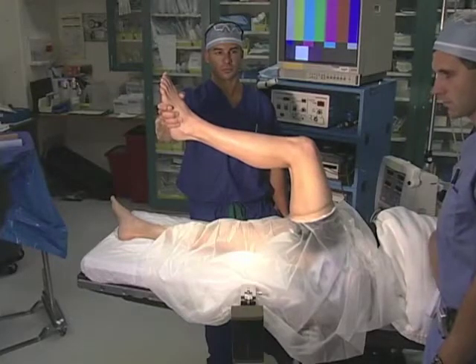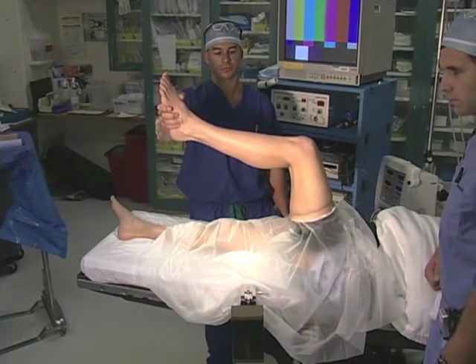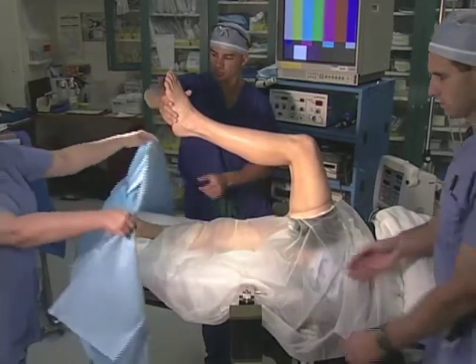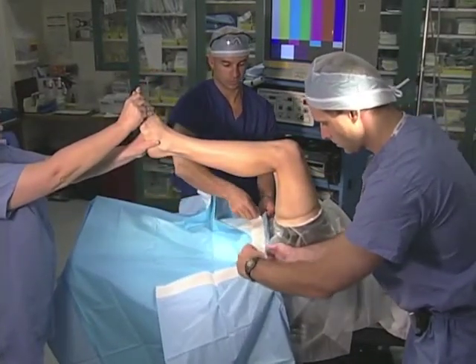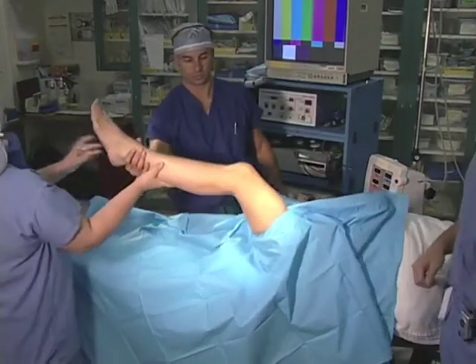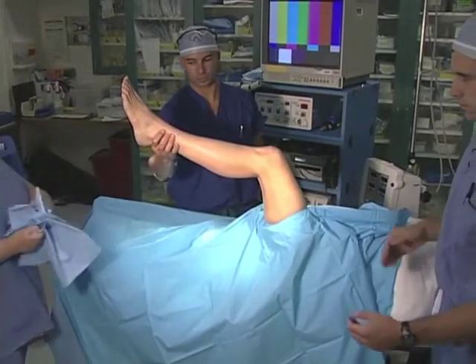Now we are going to demonstrate draping for knee arthroscopy, which is performed in layers. With an assistant holding the leg, the first layer is applied by affixing a sticky drape, first with the tails going up. Next, a second sticky drape may be applied, this time with the tails facing down.